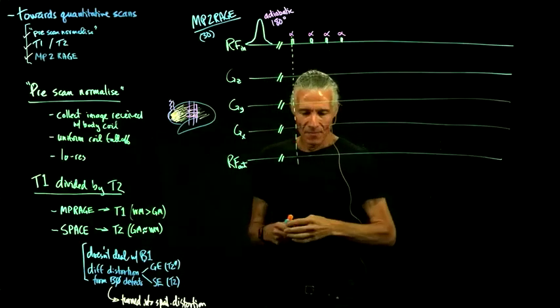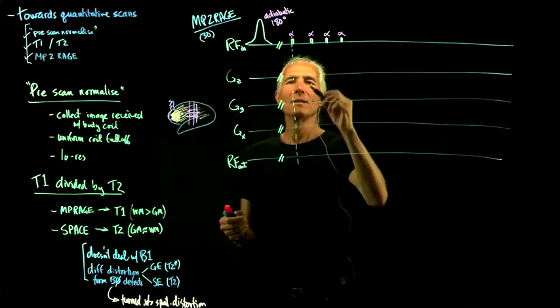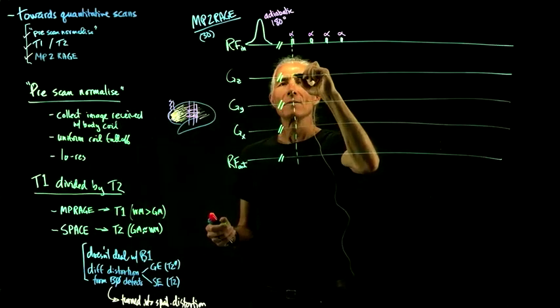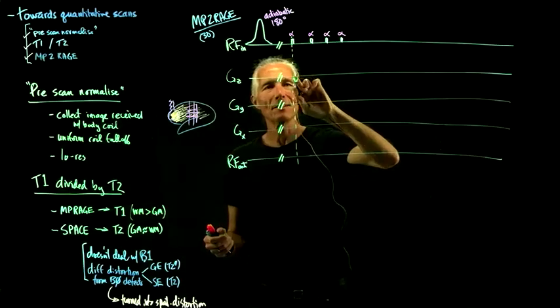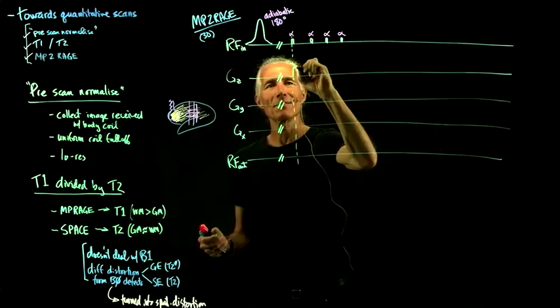And then we're trying to read out the data as absolutely quickly as possible. So we have to do some phase encoding on the partition direction. Remember, that's the second phase encode, because it's a 3D scan.